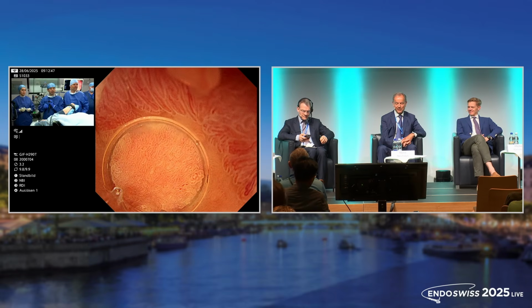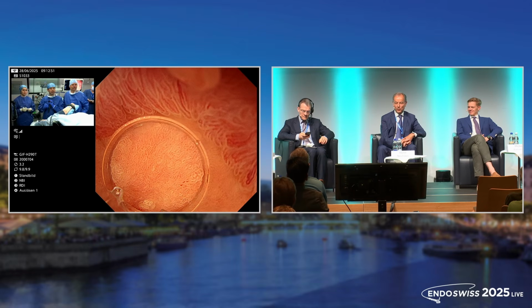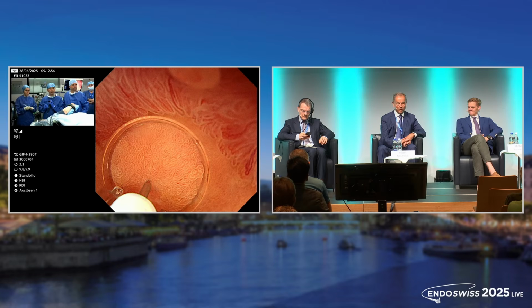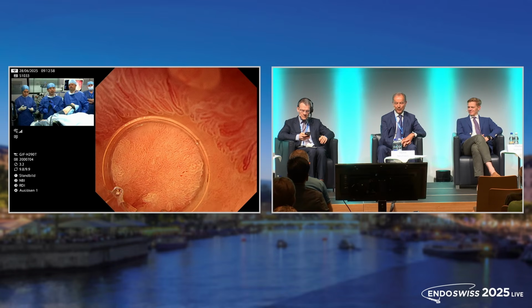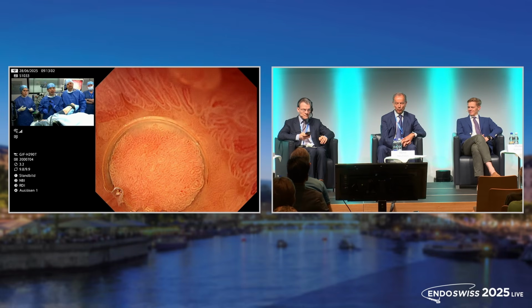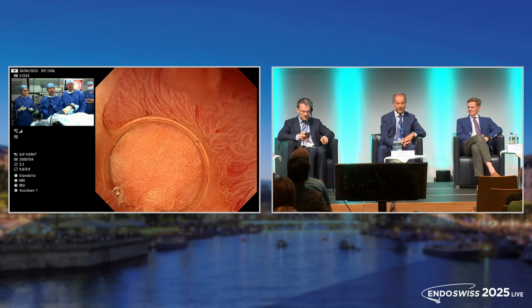So this is a nice demonstration of a rare lesion. Would we do something wrong if we would do underwater EMR, because this pedunculated lesion could be easily removed with a snare, also in an en bloc fashion? So what's the advantage of ESD in this particular case?